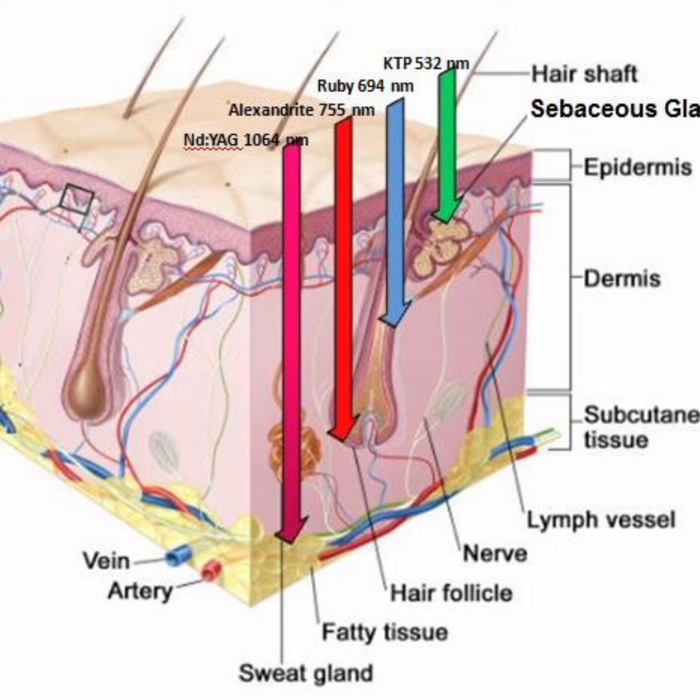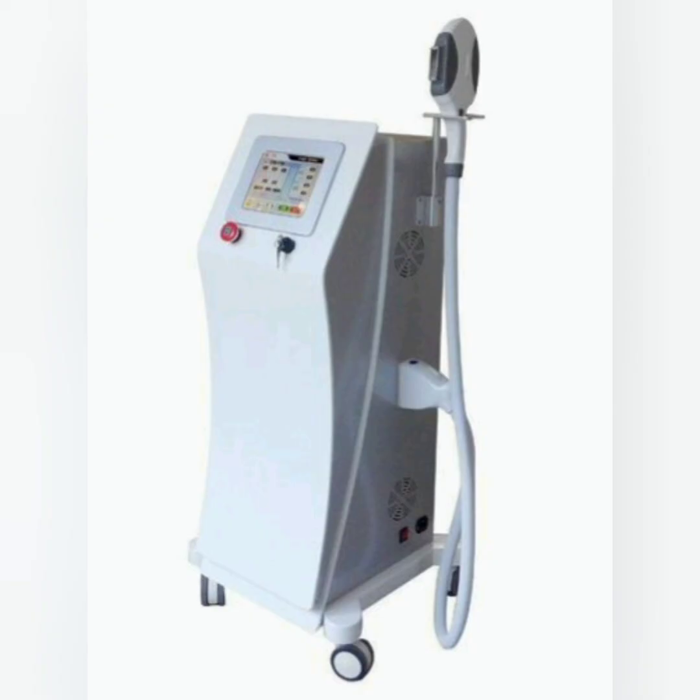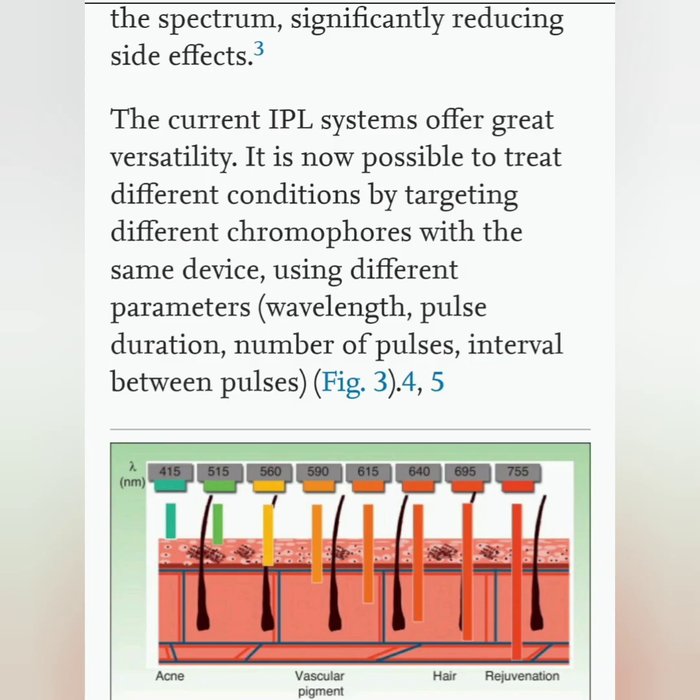So I've seen patients coming and saying pulse light is far more painful than other lasers, electrolysis and waxing. When you use a pulse light machine, it has a chill tip, but in spite of that, there are chances of burning the patient. So you have to pre-cool the treatment area, especially with the Indian skin, to prevent the incidence of burning the skin around the target area.